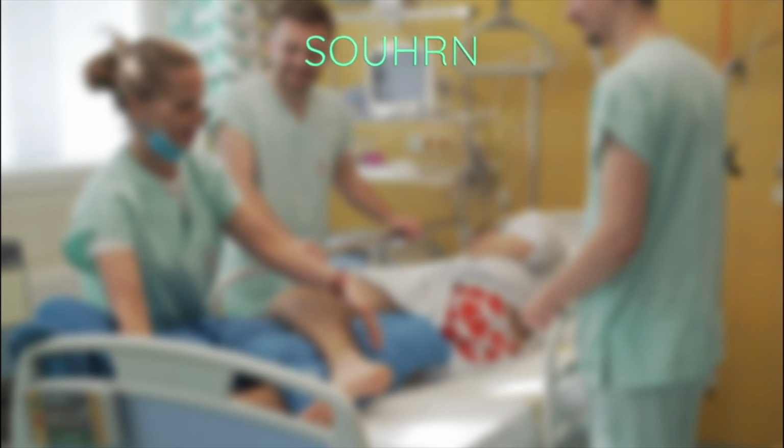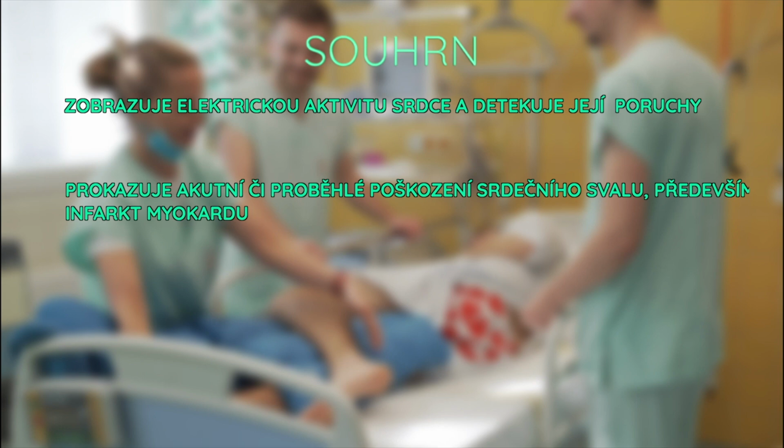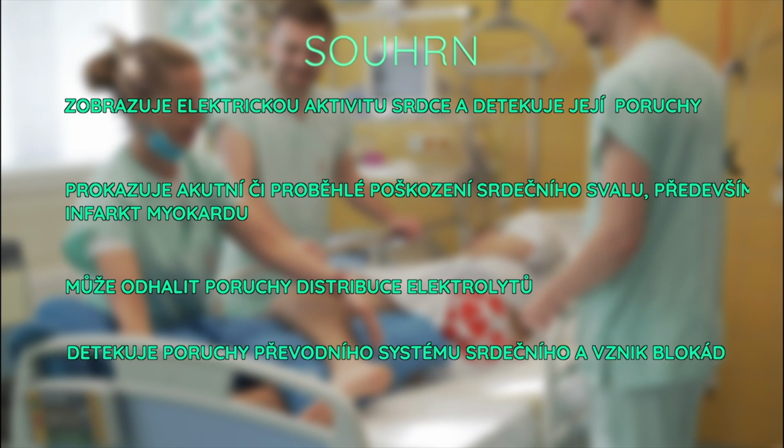Summary of ECG. The ECG records the electrical activity of the heart and detects any disturbances. It demonstrates acute or past damage to the heart muscle, especially myocardial infarction. May uncover issues with electrolyte distribution. It detects disorders of the heart's conduction system and the development of blocks.